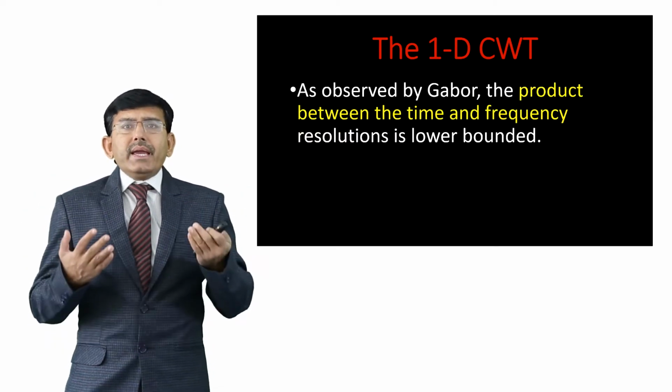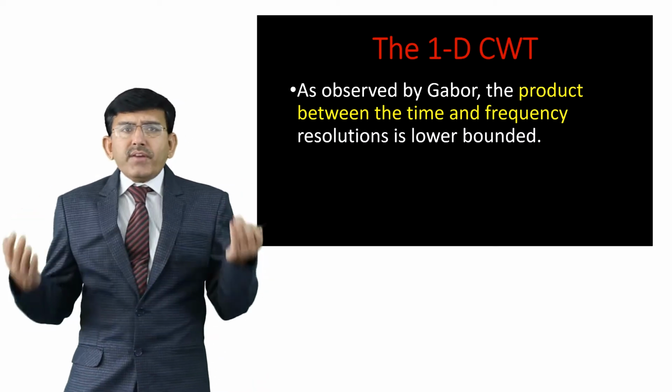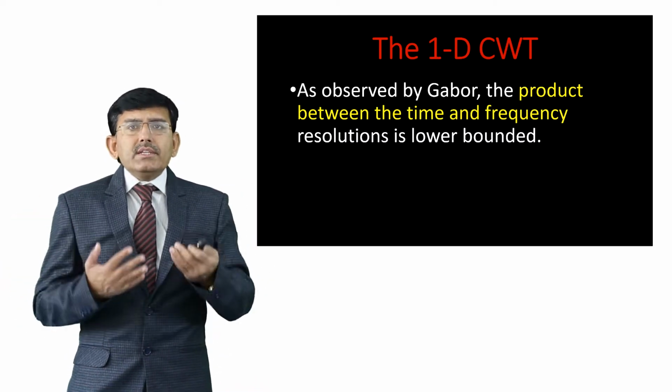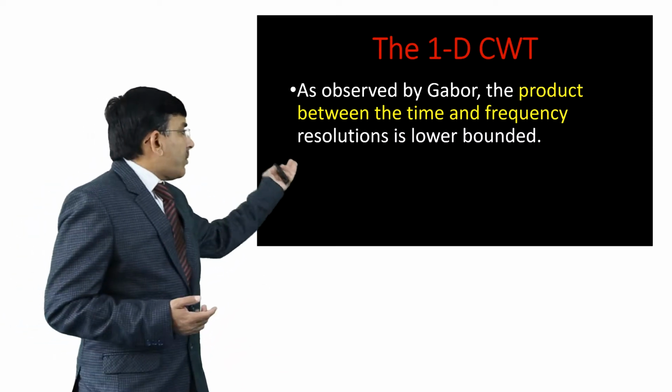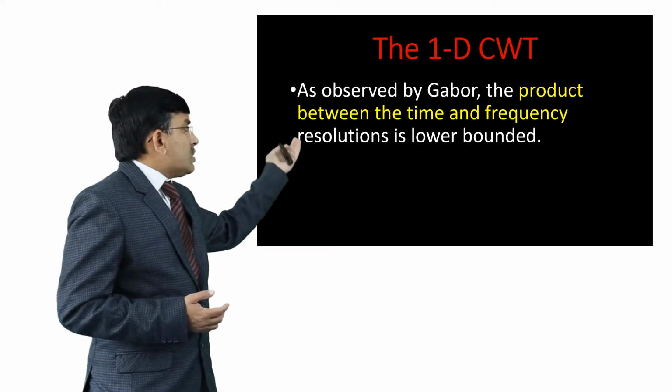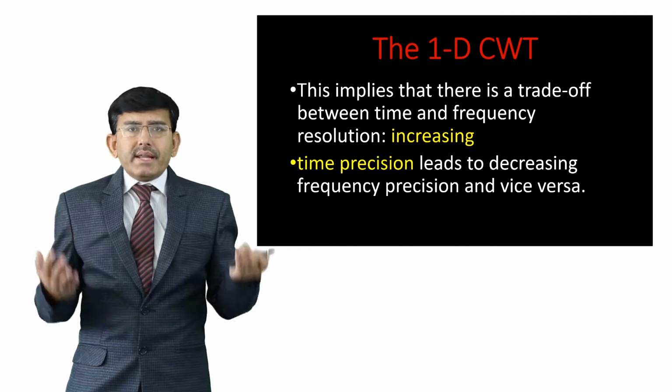As observed by Gabor, the product between the time and frequency resolution is lower bounded. By taking this particular property, it is possible to analyze the image coefficient in all directions.